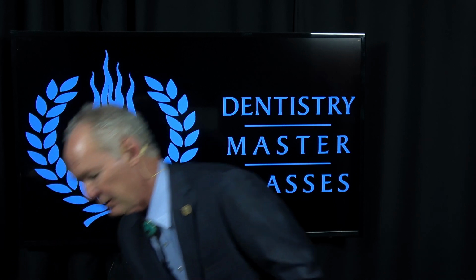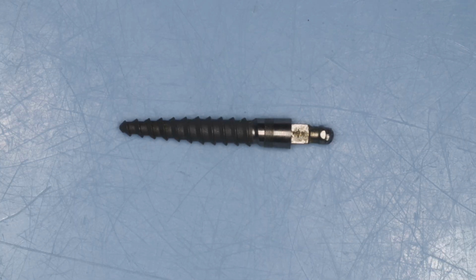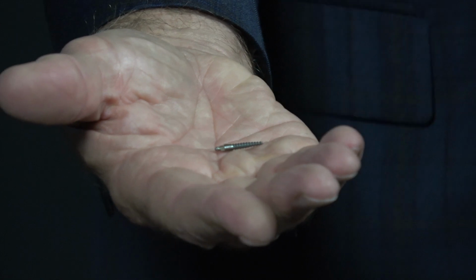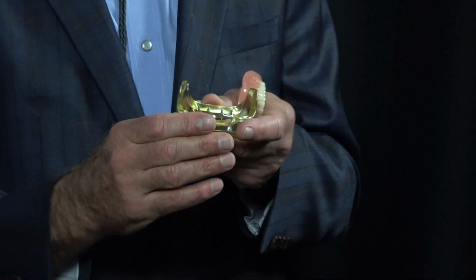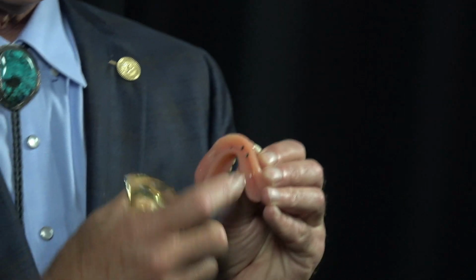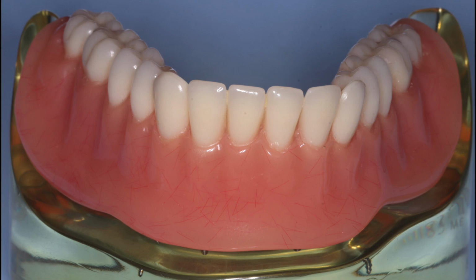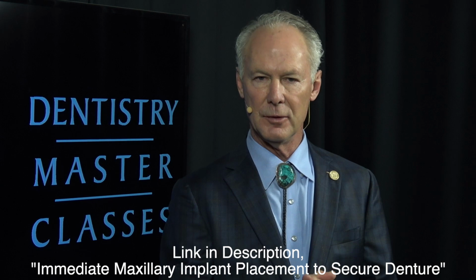Now, something we do a lot of are implant retained, removable, and non-removable prostheses. This is a small diameter implant. You see it's smaller than the root form implant. A small diameter implant is less than 3 millimeters in diameter. And you screw those into the bone, let the bone osseointegrate, and then the denture has these housings that fit onto the implant, and they're very stable. You can watch my video on small diameter implants retaining removable dentures.